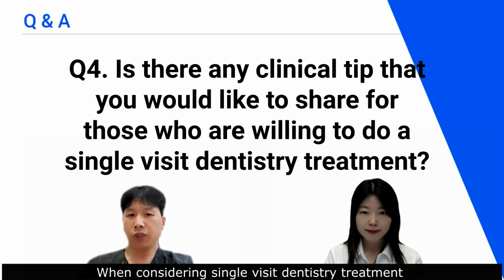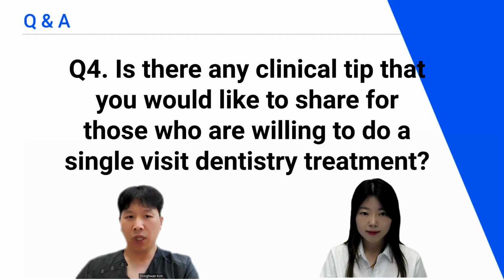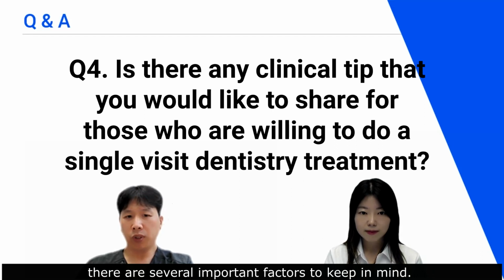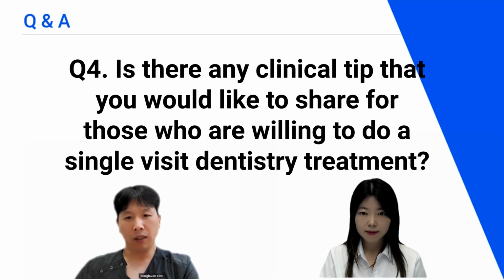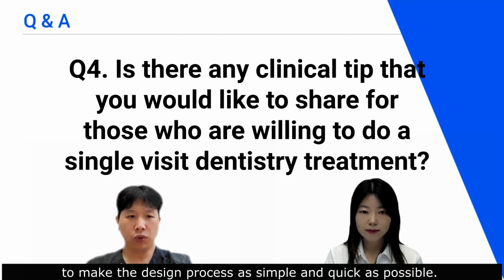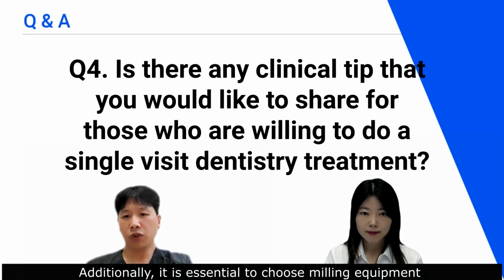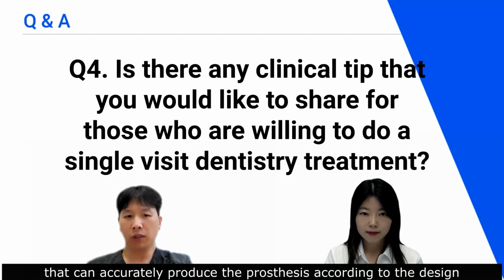When considering single visit dentistry treatment and performing the design and fabrication in-house, there are several important factors to keep in mind. One of the most crucial aspects is to make the design process as simple and quick as possible. Additionally, it is crucial to choose milling equipment that can accurately produce the prostheses according to the design specifications.